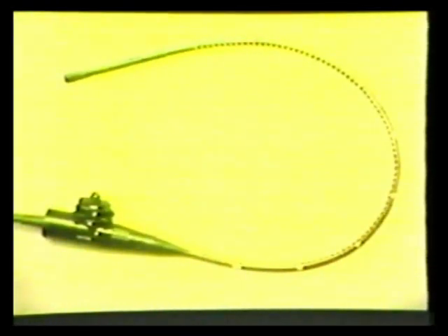This is a typical echocardiographic endoscopic transducer. The elements are mounted at the tip of the transducer. There are knobs which allow movement of the scope tip and transducer. The electronics exit through the handle. The actual scope is approximately 100 centimeters in length, 9 millimeters in diameter, and is marked in centimeter markings. The typical tip is approximately 11 millimeters in diameter. The shaft is about 9 millimeters in diameter. This is a typical adult-sized endoscope.